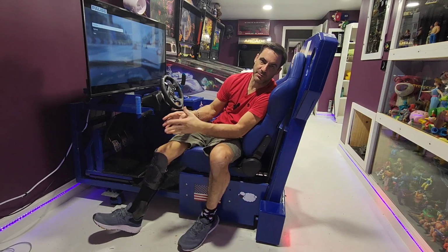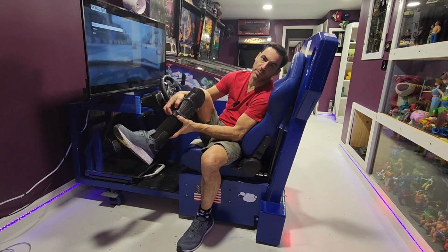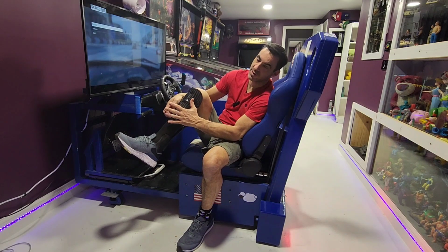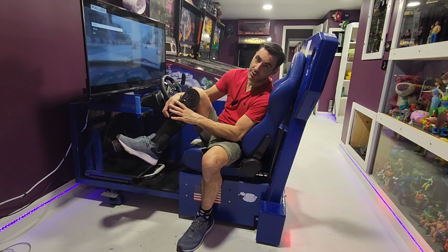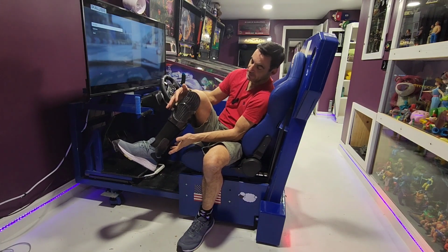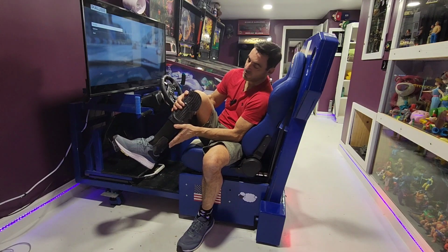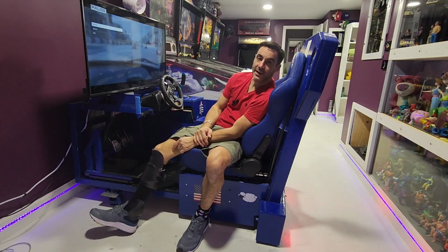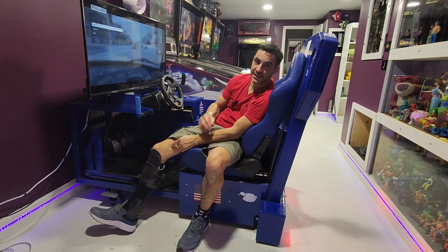So it's like being in one of those medical boots. If ever you sprained your ankle or broke your ankle, you've seen them grey medical boots. It's like that, but this is a lot stronger, a lot better fit with zero movement. Those medical boots, you can get some movement, zero movement in this. And it's a lot lighter and stronger than a medical boot. So I basically live in this until I get my ankle replaced. So maybe 10 years in this thing.